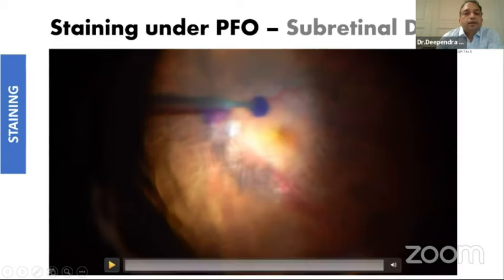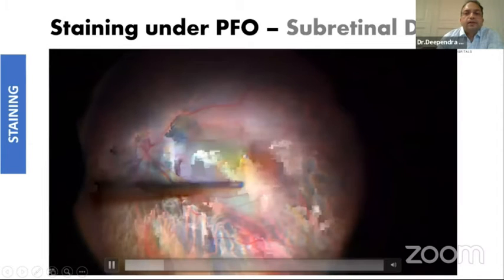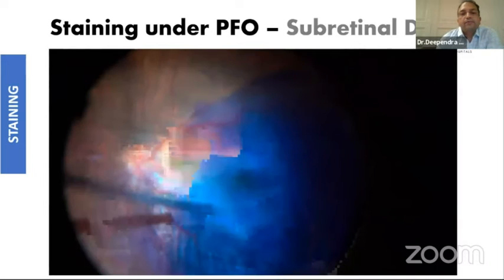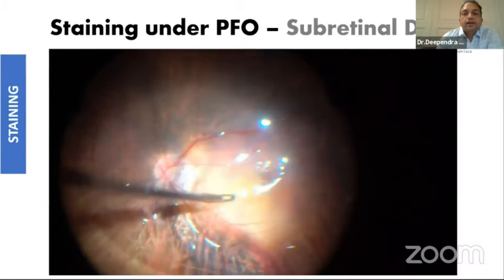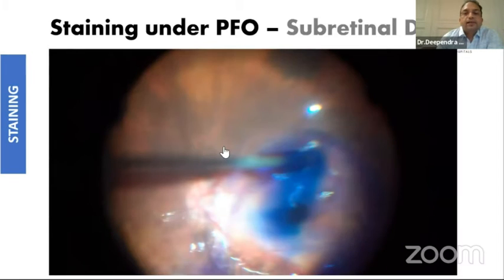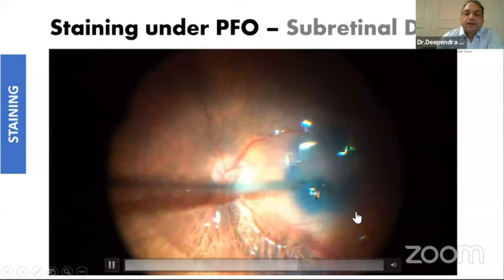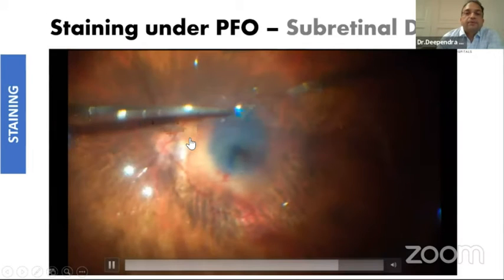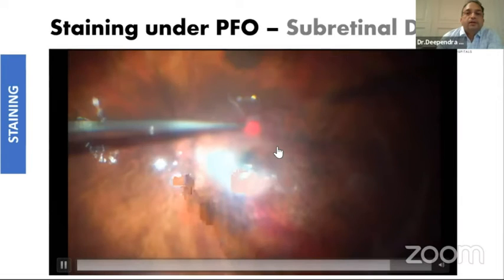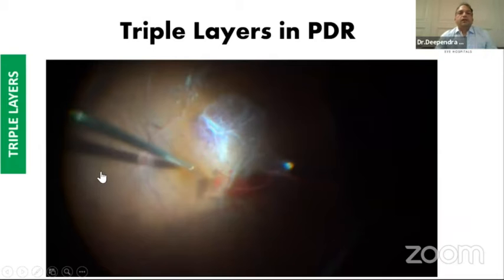In high myopic eyes sometimes there can be paravascular holes. In this case I am staining and the contrast was not good enough, so I'm staining again. I try to peel under PFCL but because of the poor contrast I am having difficulty. What happened is the moment I injected dye under PFCL it went subretinal. I could still feel the ILM and got some contrast, but this is something you don't want — subretinal dye. I was able to reposition the flap under PFCL over the macular hole, but then I had to create another hole superiorly to drain this subretinal dye because I didn't want to leave dye in the submacular space.